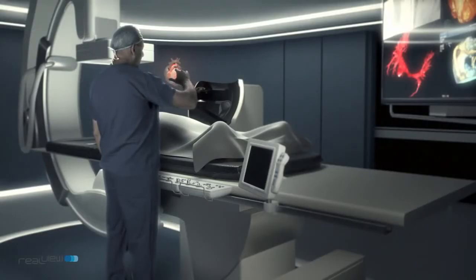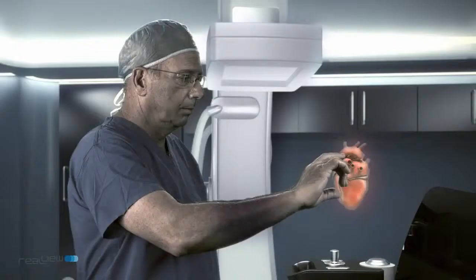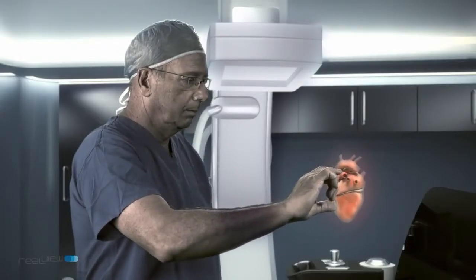We are targeting our products to be used in the future for surgical pre-planning, medical robotics and 3D fetal imaging, as well as for additional medical and non-medical applications.